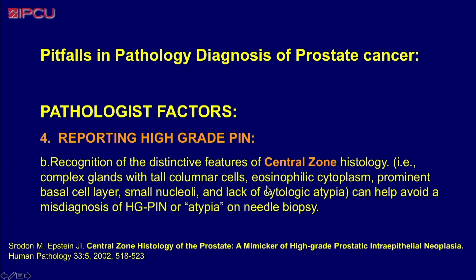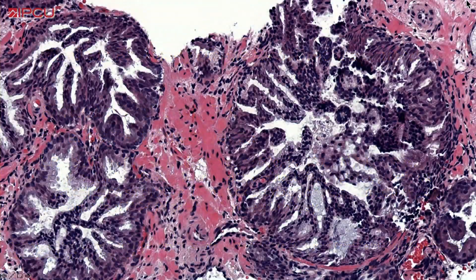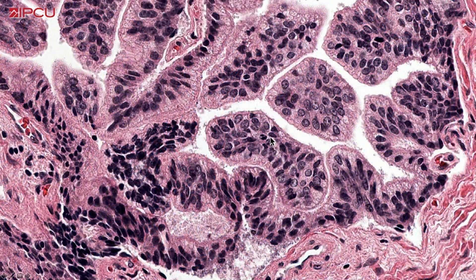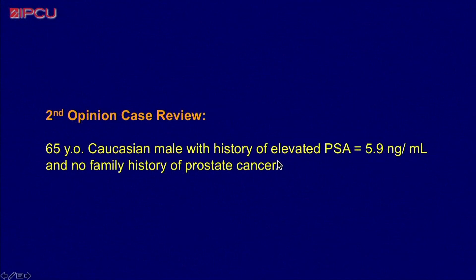Then there is over-calling, which is a very common source of discrepancy. It can confuse some pathology colleagues. The central zone is normally a very complex gland — with glands within glands and high-grade PIN-like appearance. This is normal. When the biopsy has reached an unusual area of the prostate, we need to be careful not to over-call it as high-grade PIN.